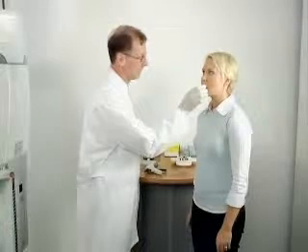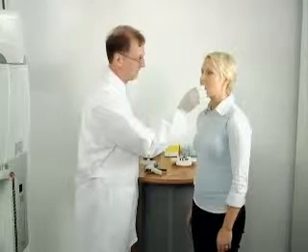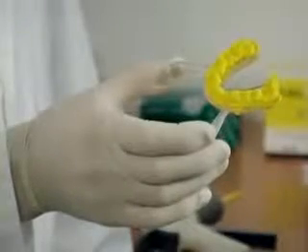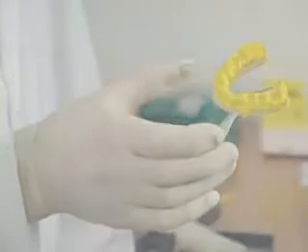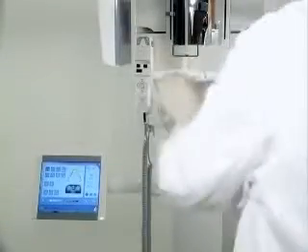Taking the VT pan image. Replace the standard chin rest with the VT panoramic positioner and attach the bite index. Note that the OP unit automatically switches to VT panoramic imaging mode. Please check that you have the panoramic collimator selected.